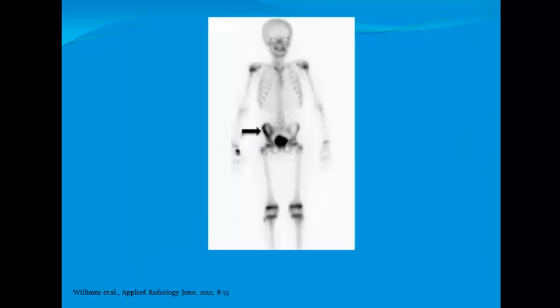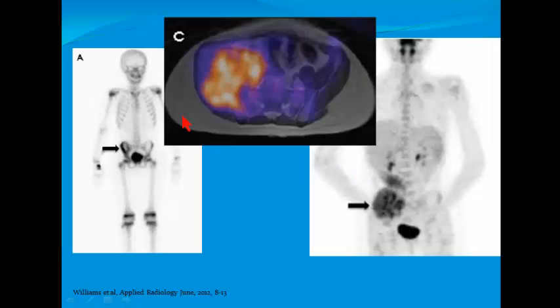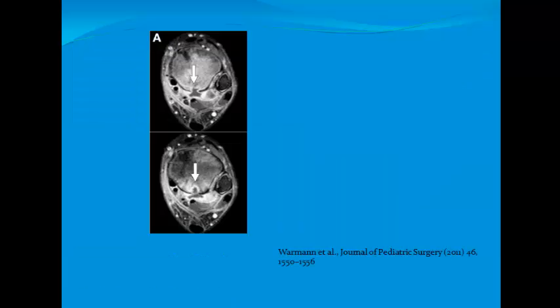And here's another case of a patient with a Ewing sarcoma with uptake, or activity, on the bone scan in the right ilium. And we can see activity on the FDG PET scan in the tumor mass, which is greater than that implicated by the bone scan. And we can see on the combined MR FDG images here the anatomical outline of where the FDG uptake is, and would have, again, a good description of where the lesion would be for surgeons potentially.